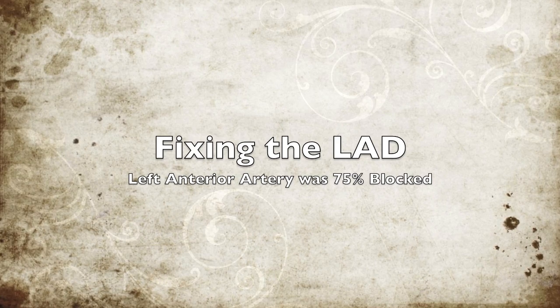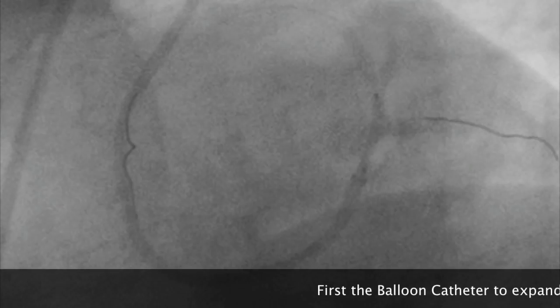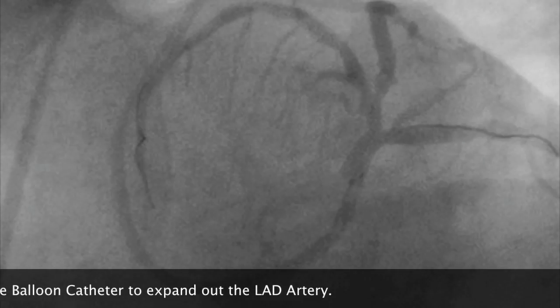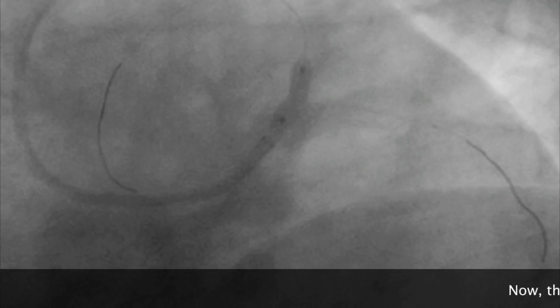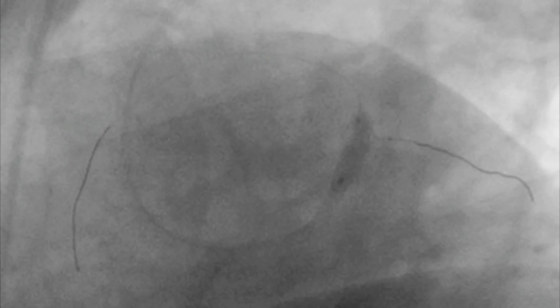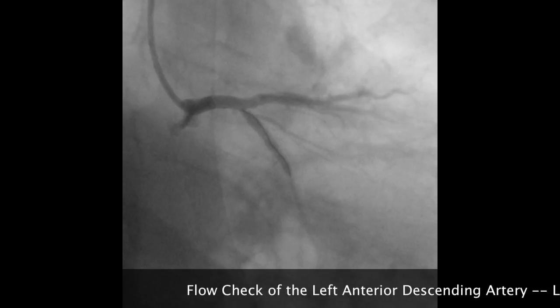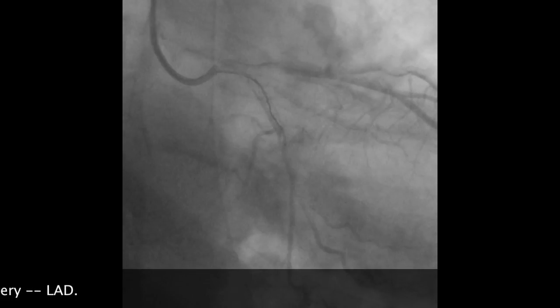Now they're going to fix the LAD — the left anterior descending artery. First, the balloon catheter is expanding into the LAD artery, which was 75% blocked. They're placing the stent in the LAD and expanding it out — you can see how big and puffy it is. They're doing a flow check on the LAD, and it's back up to 100% now.